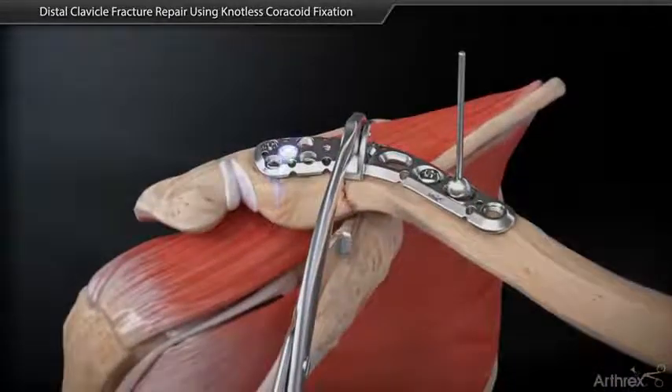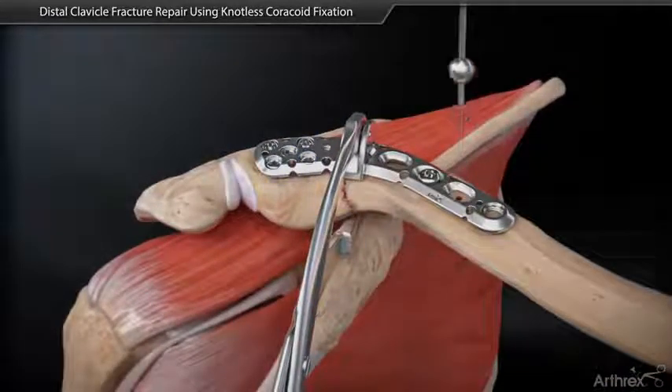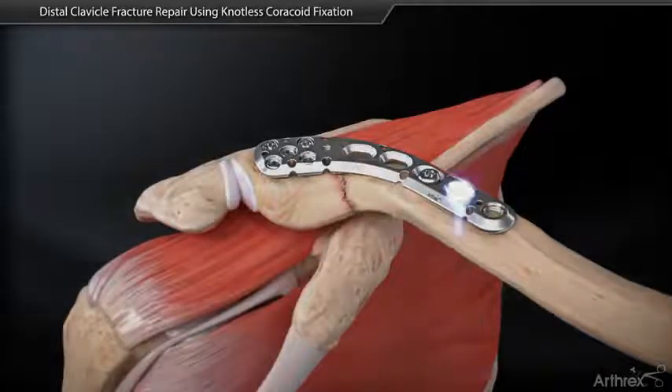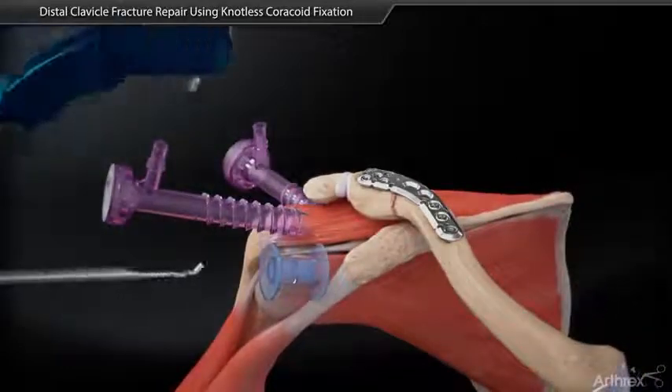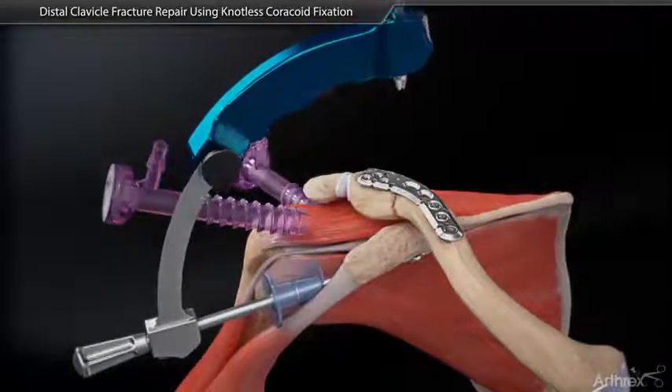Repeat for the other desired screws. Place the A.C. guide at the base of the coracoid.